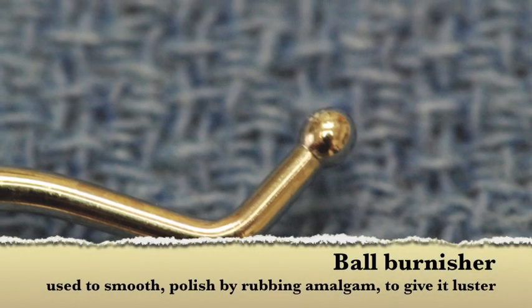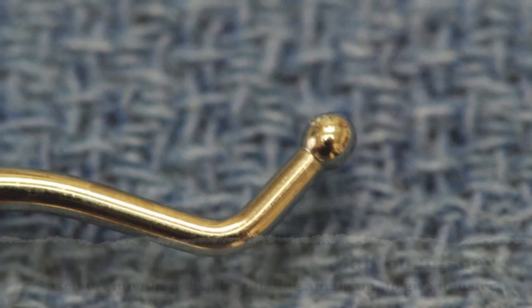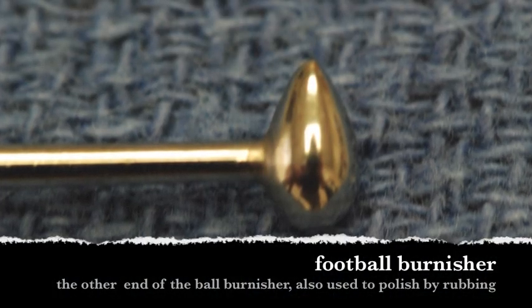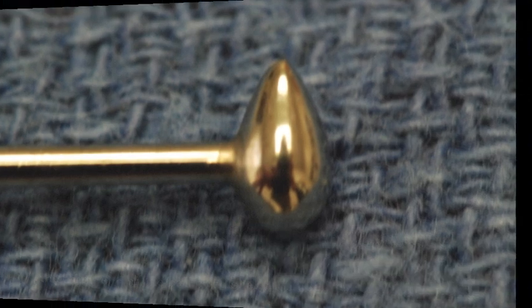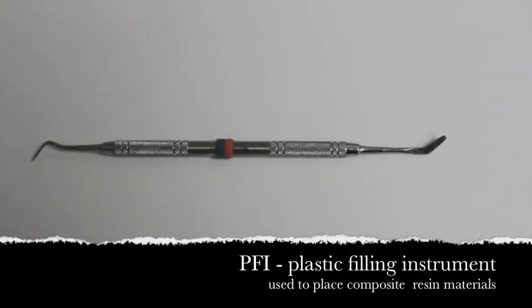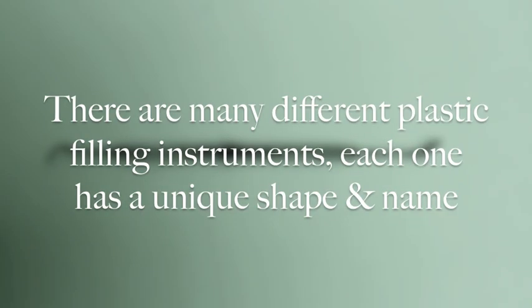This is called a ball burnisher and the other end is called a football burnisher, and these designs are used to burnish or to polish by forceful rubbing against the surface of metal. Plastic filling instruments are a class of instrument used to give shape and to develop anatomy during the placement of composite restorations. This is but one example, as there are many different kinds and shapes of PFIs.